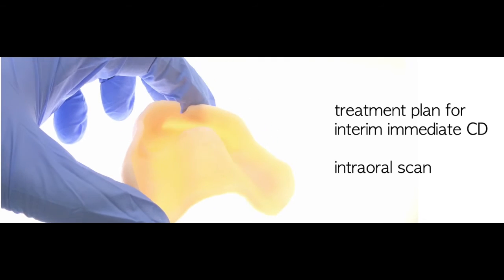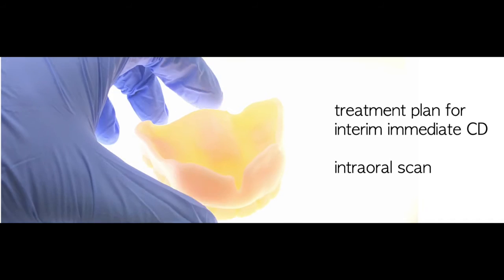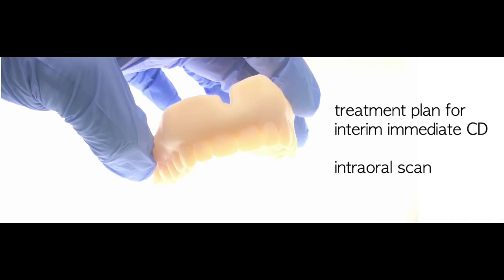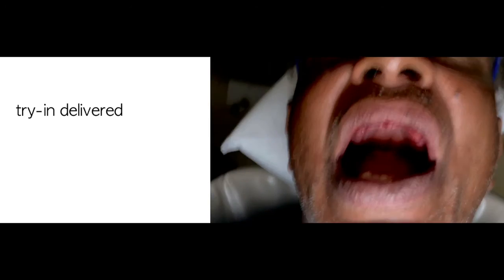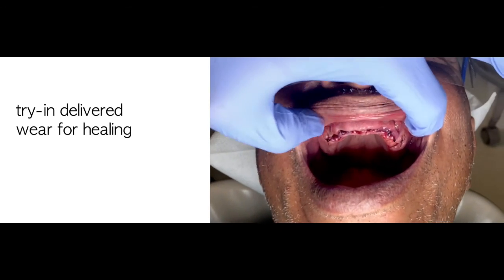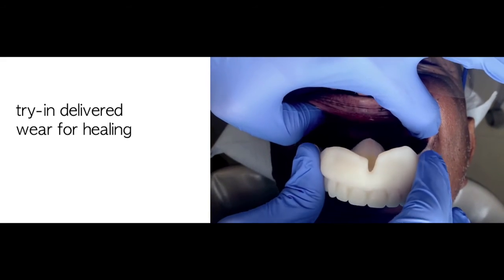And as we planned, we're going to deliver this try-in denture right after the teeth are removed. So patient got the extraction done in the morning, and patient came back to the clinic for removable.